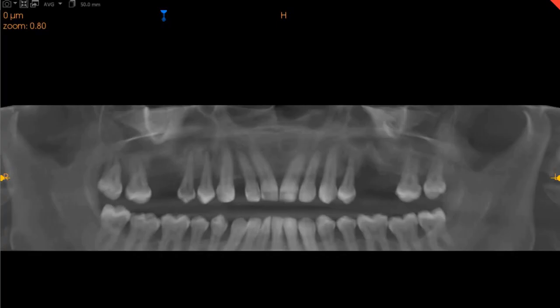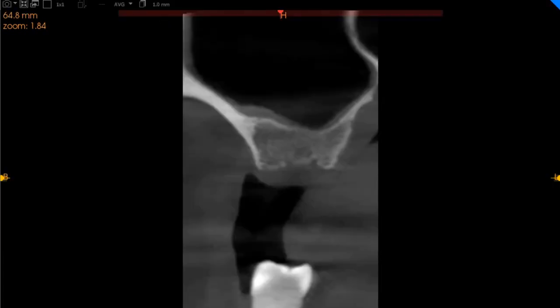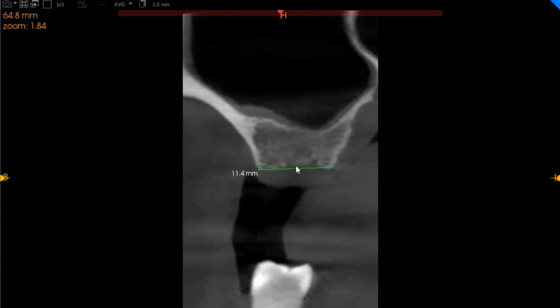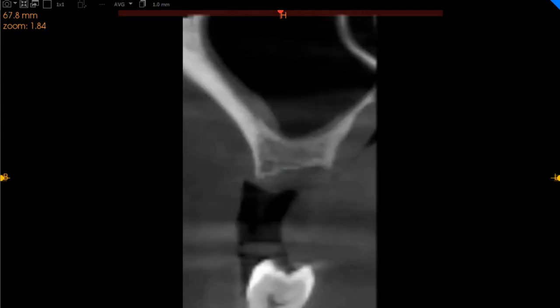Starting with the upper right quadrant, you've got a missing upper right six. This is the center of the ridge trans-axial view. We've got approximately 11 millimeters of ridge width with 5 millimeters of height. So a short implant will be placed, but the internal sinus lift will definitely be preferred.